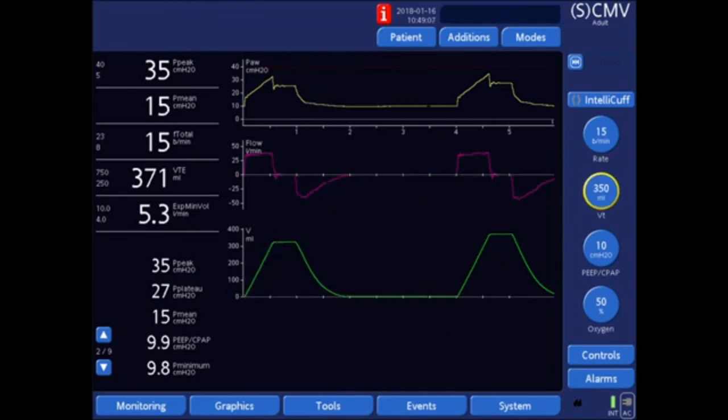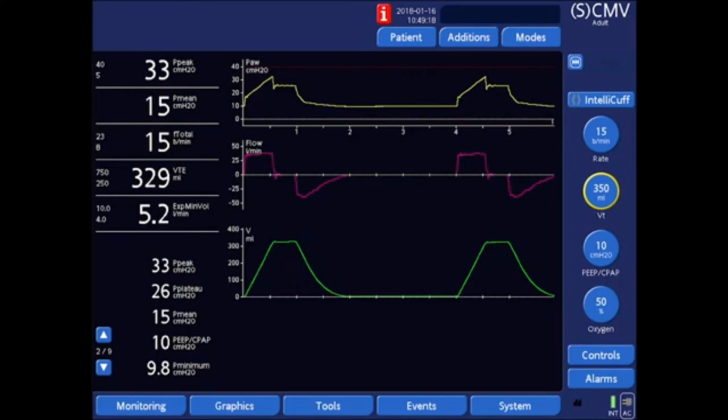So how do you accomplish reducing driving pressure by just turning the ventilator knobs? After what we just noted, you do them by increasing the PEEP, reducing the tidal volume, or by doing a combination of the two. Oftentimes, making independent adjustments of either of them, followed by close observation and repeating the changes to one of these parameters, may be necessary to optimize ventilation for your patient.